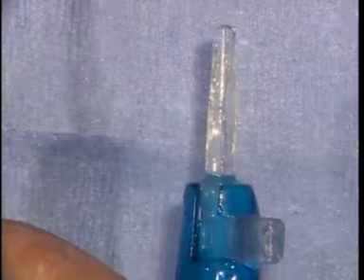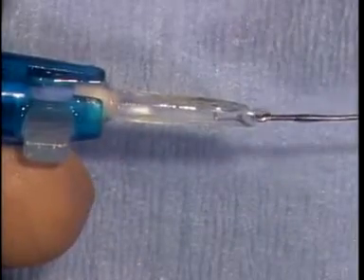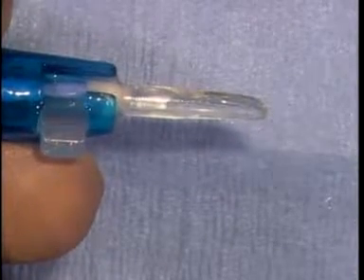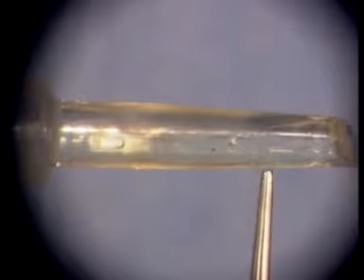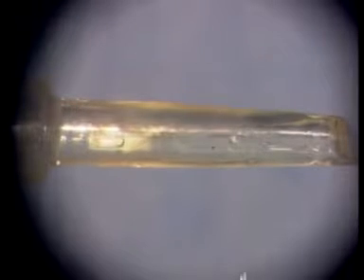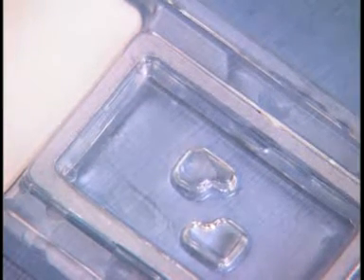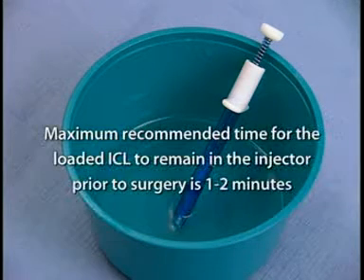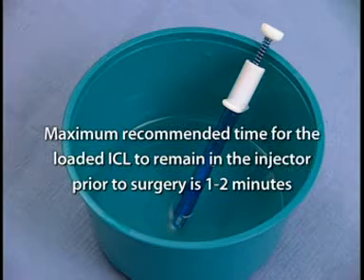Advance the plunger until it is in contact with the lens. The final lens position should be within approximately two millimeters of the end of the cartridge. Evacuate any air bubbles from the loaded cartridge with methyl cellulose type viscoelastic injected into the tip of the injector using the cannula to backfill the cartridge. Using the operating microscope, check that the ICL is properly oriented by observing the landmarks on either side of the optic — these marks should be visible at the 12 o'clock position and be in straight alignment down the shaft. If the ICL is improperly aligned or oriented, it may be twisted and should be injected into the cartridge tray and the loading process repeated. Place the fully assembled injector, tip down, into a container of BSS to maintain lens hydration. The maximum recommended time for the loaded ICL to remain in the injector prior to surgery is one to two minutes. The injector is now properly prepared.